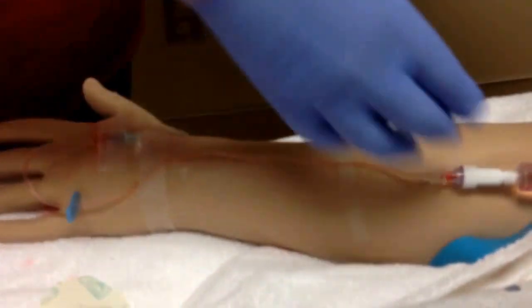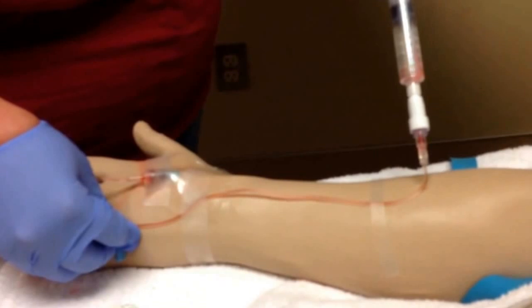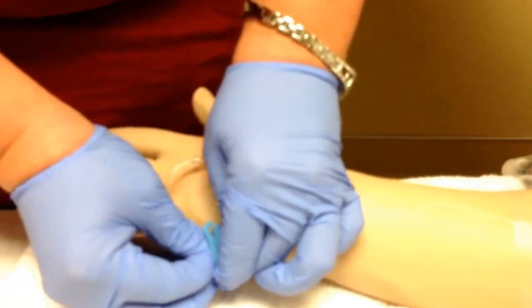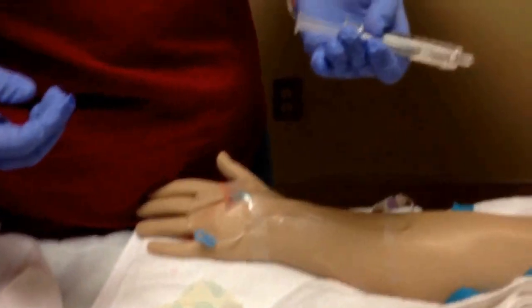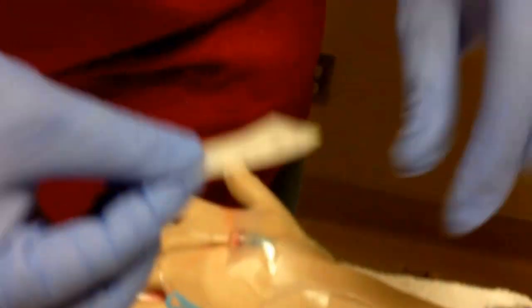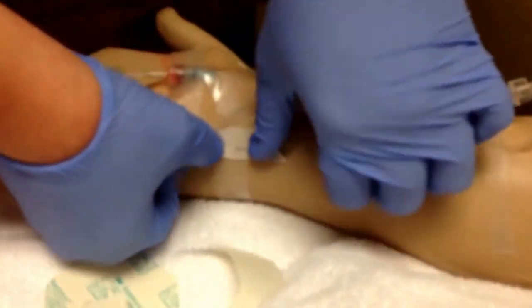If you see blood has backed up into your catheter, go ahead and flush it again to make sure we don't lose the IV site. Put the cap back on and clamp it off. Now we have our IV secure. Both the needle and syringe need to go in the sharps container. I'll label this with the date, time, my initials, and the gauge — mine was a 22 gauge. Don't put the label over your site because you need to be able to visualize it; put it to the side.